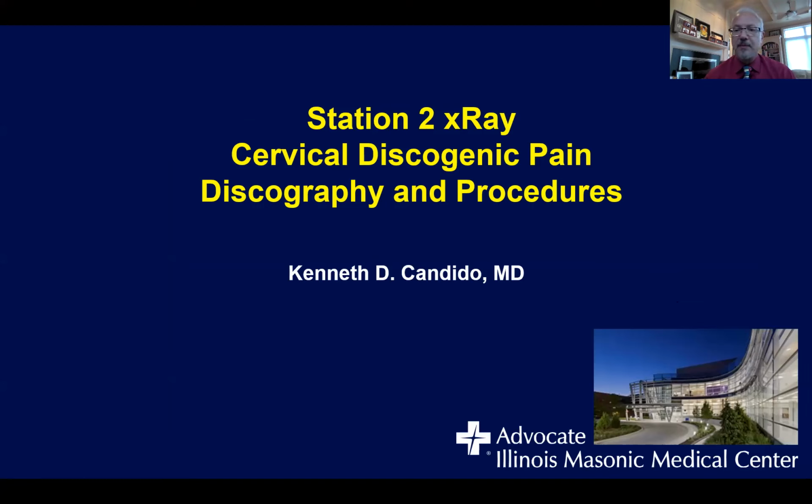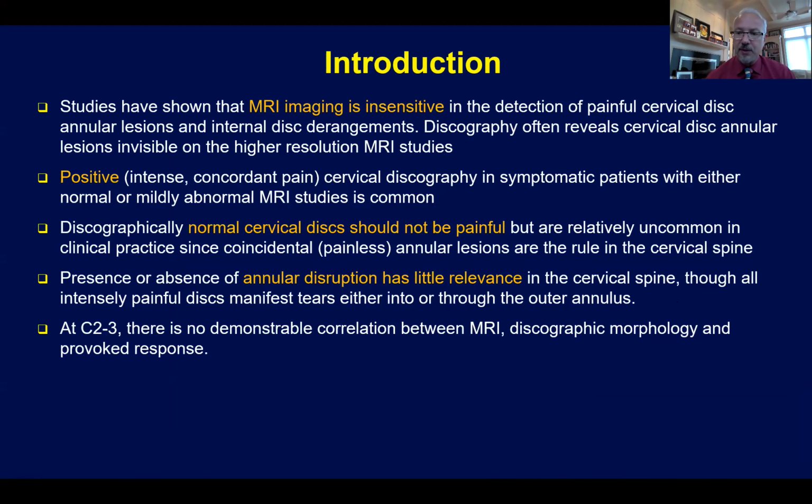Today we're going to describe cervical discography and provocation discography, I should say, for discogenic pain of the cervical spine. I have no disclosures related to this educational activity.